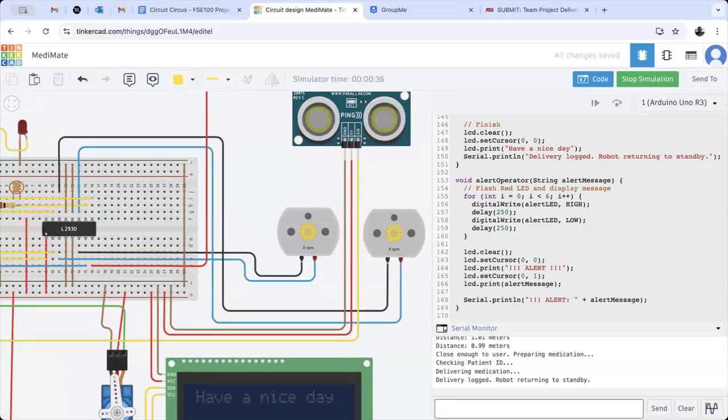So let's just say it needs to alert. We'll send an alert command, and you see the LED is blinking now.